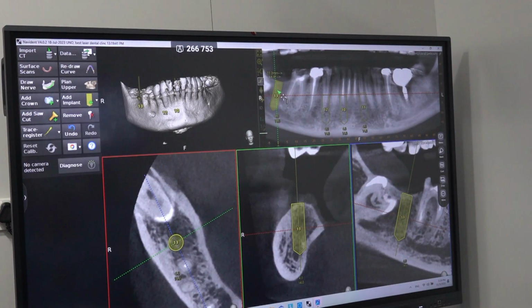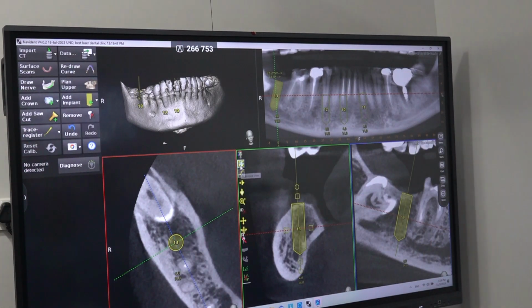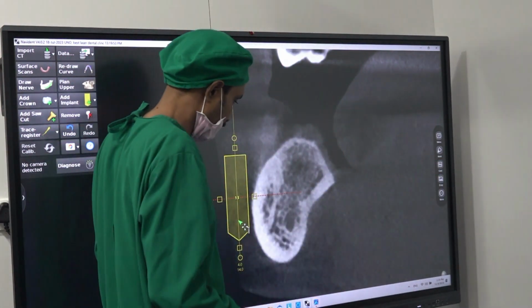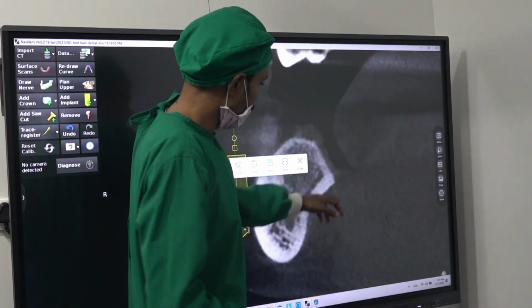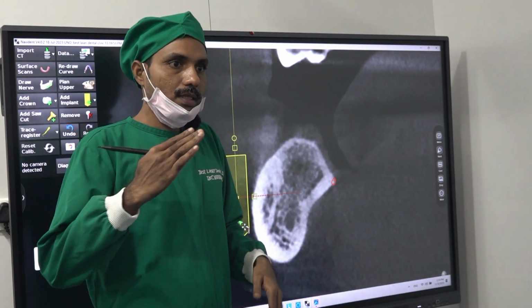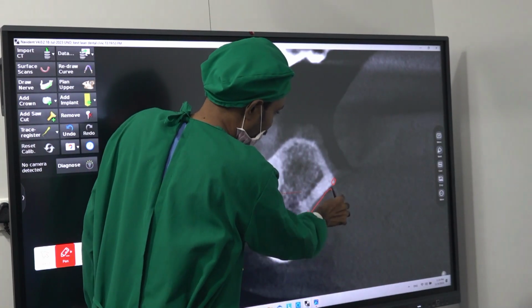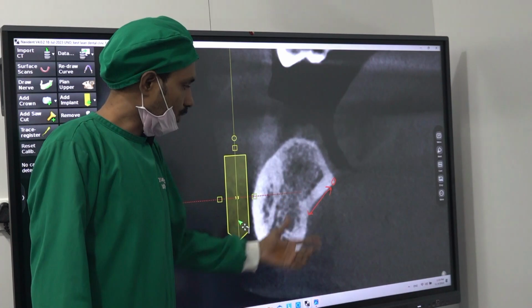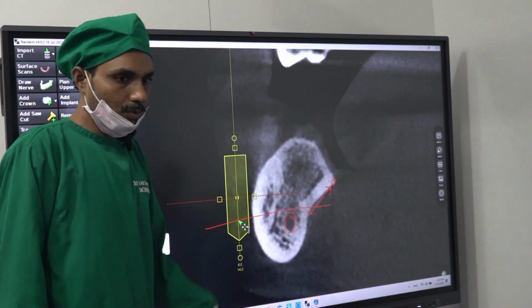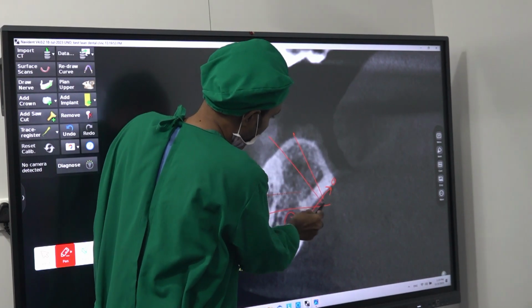This is the second molar area where Madam told we can place an implant as the key to the second molar area. See the mylohyoid ridge. It is more prominent and it is higher, because as the mylohyoid ridge goes back, it becomes closer to the crest. See, this part becomes more. A lot of area for us to engage. As you see, this is the inferior alveolar canal, which is below the deepest point. So place the implant like this or like this, whatever it is.